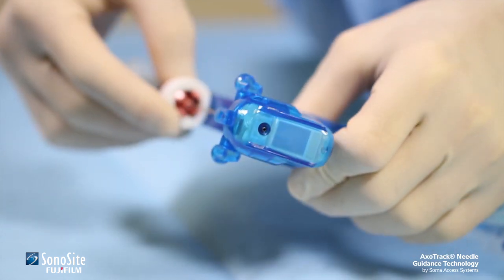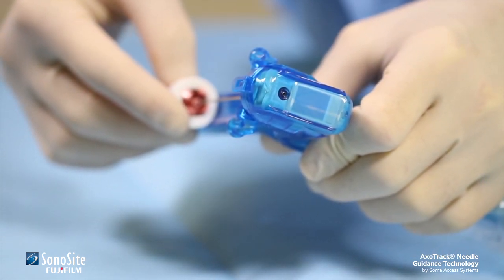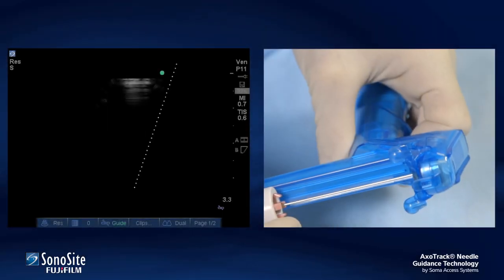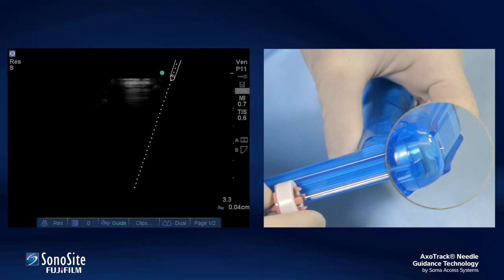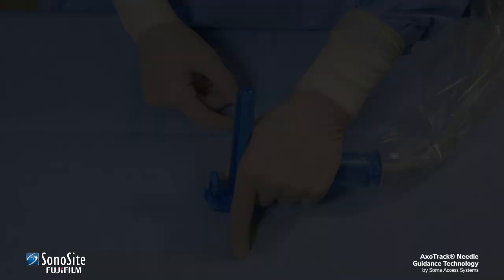As a final check before use, the practitioner passes the needle through the needle guide and observes when the needle tip starts to protrude from the bottom of the transducer shield. At this point, the image of the virtual needle should be seen just entering the very top of the ultrasound field. This step confirms calibration is correct.